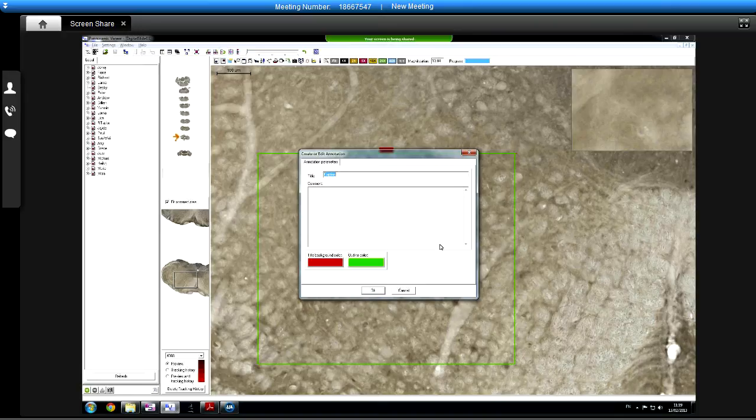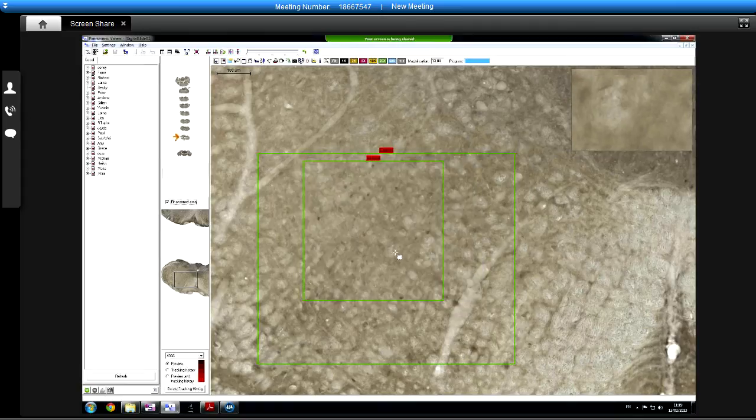And the other reason why it's a good idea to put something in here rather than just caption is that if you subsequently export a CSV file or a spreadsheet file with some data on, each line with different counts and things in will be labelled with whatever you've typed. So it makes sense, when you're marking them, to call them something, whether it's section 1, section 2.